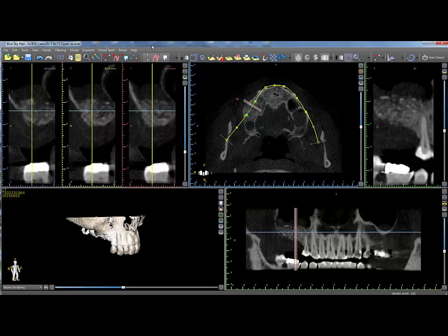Blue Sky Plan contains all the treatment planning tools to make placement and control of implants, abutments, and virtual teeth very intuitive. It is recommended to have the proposed site viewable in the panel or cross sections prior to placing the implant.